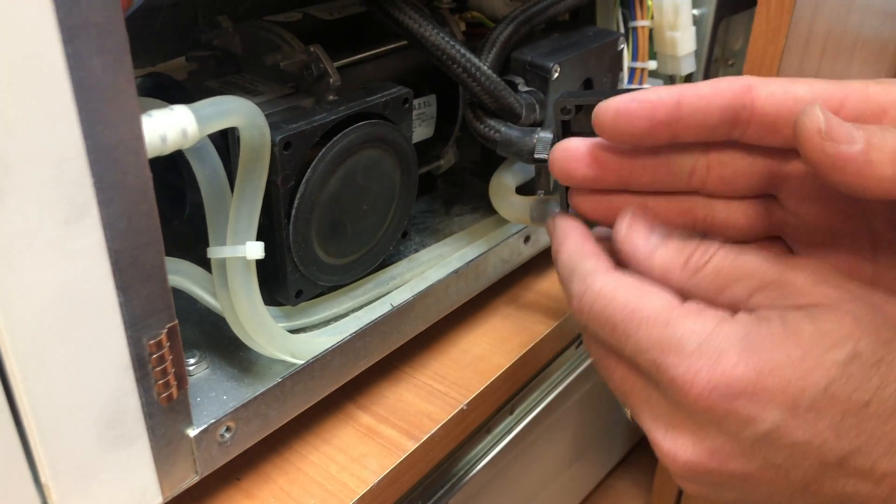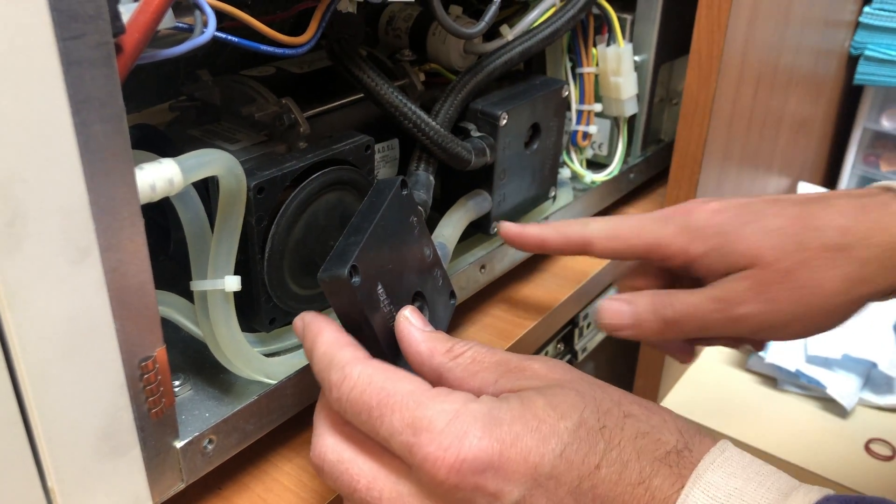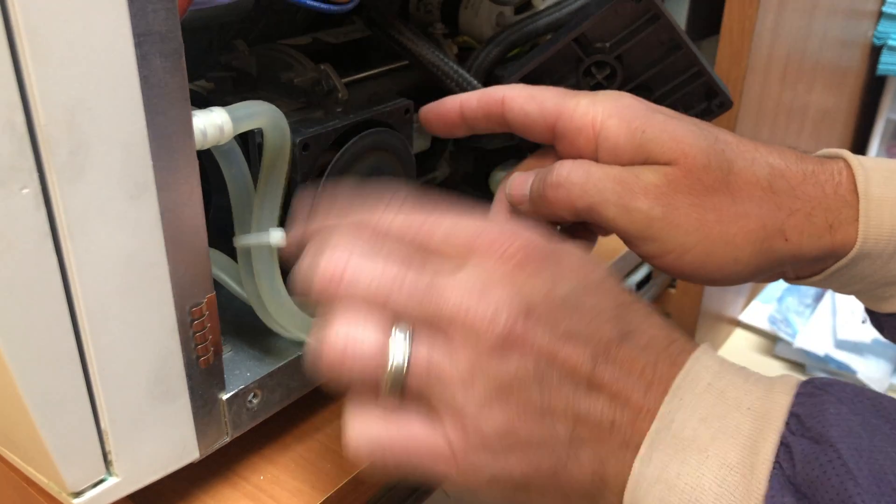They have a rebuild kit. So you unscrew it — you take out these four bolts right here. I already did it on the other side. Then you unscrew the membrane.